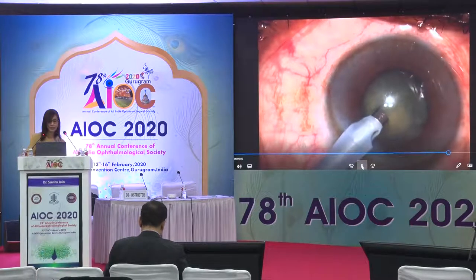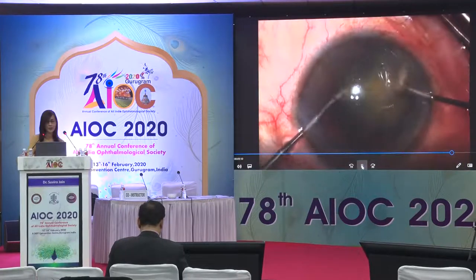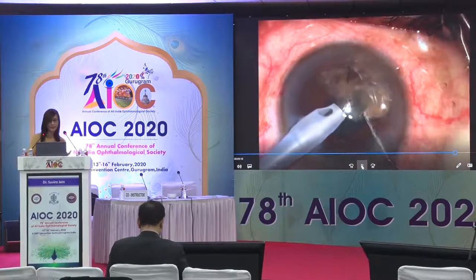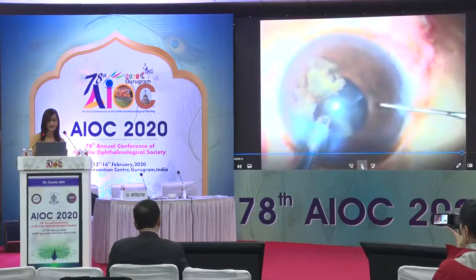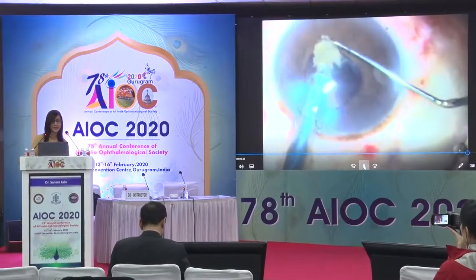The next case shows a pupillary snap and the surgeon notices in this grade 3 polar cataract a propensity of the nucleus dropping. The surgeon brings the nucleus into the anterior chamber — though today I would suggest this is not a good idea due to risk to the corneal endothelium. In another case with grade 3 nuclear sclerosis, emulsification is going well, and then the surgeon notices the last fragment starting to sink. You don't go after it — put in dispersive viscoelastic, emulsify the last bit, do a visco-BSS exchange. There was still vitreous disturbance, so a limited anterior vitrectomy was done. Without a three-piece lens, the incision was extended to 5 mm and a rigid lens was placed in the sulcus.